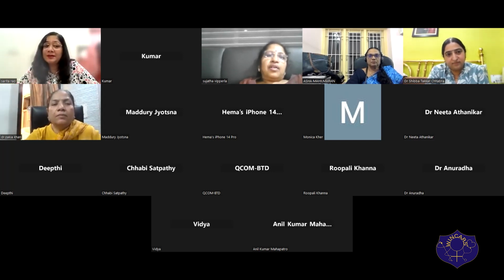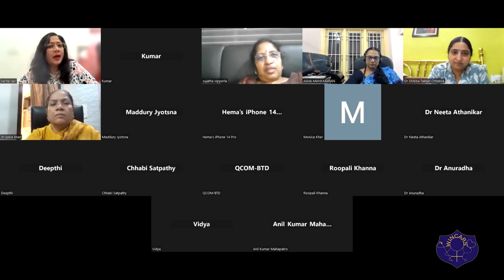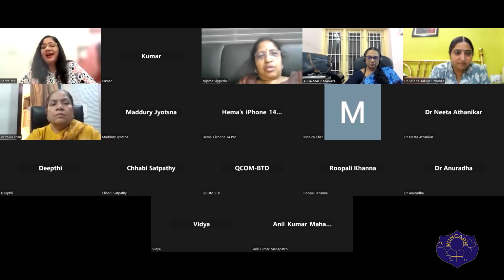Sarita, I have a question. Let's say we have no financial issues at all, would you do only orbital and forget rota? Absolutely. I have all three: I have rota, I have orbital, and I have IVL. In fact, just now, I have done an orbital case.